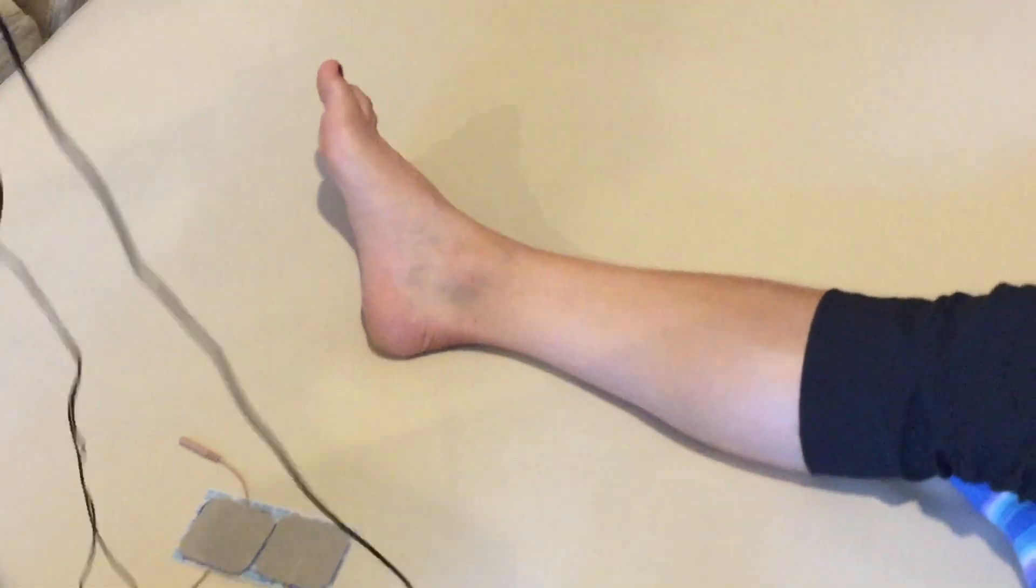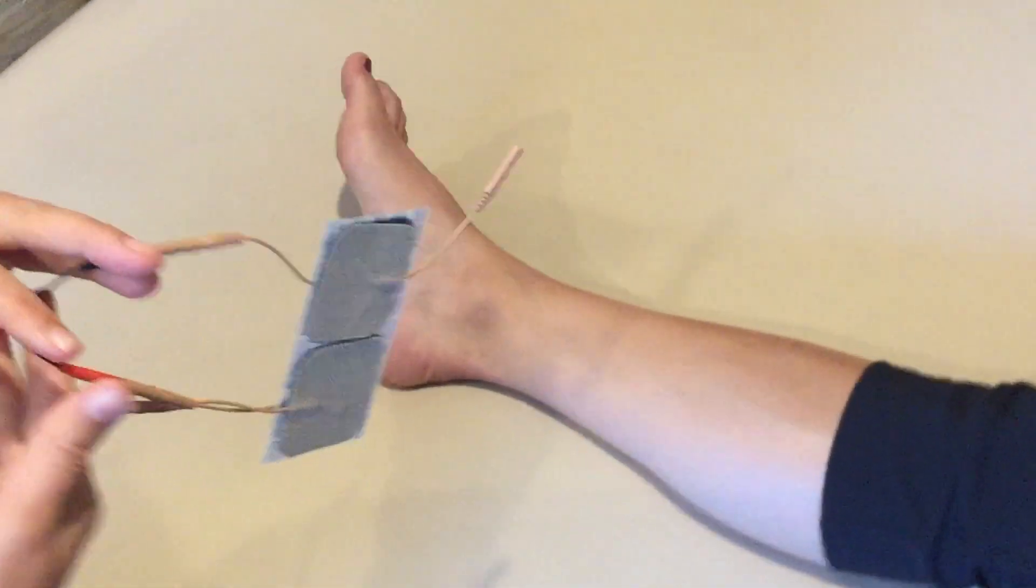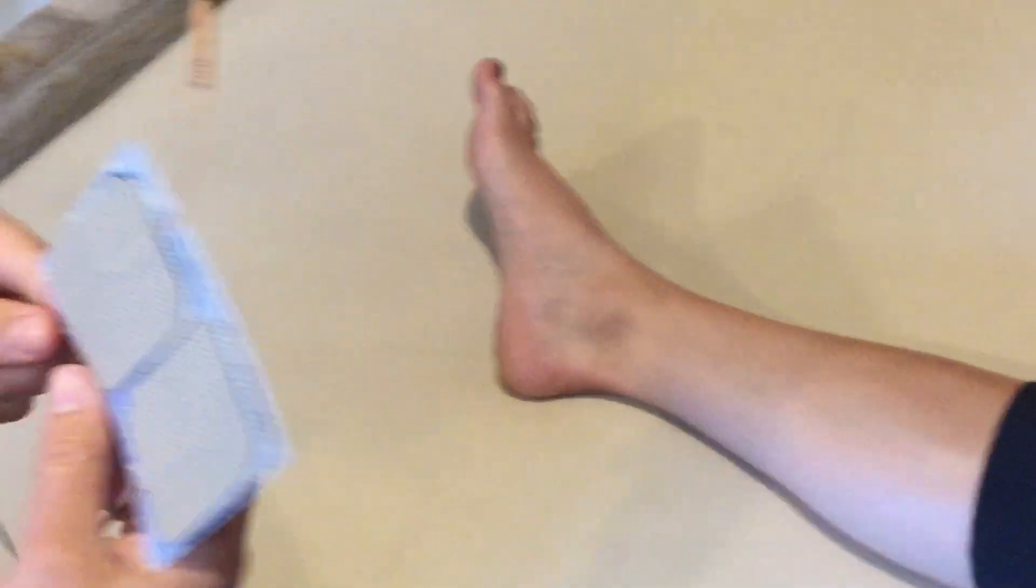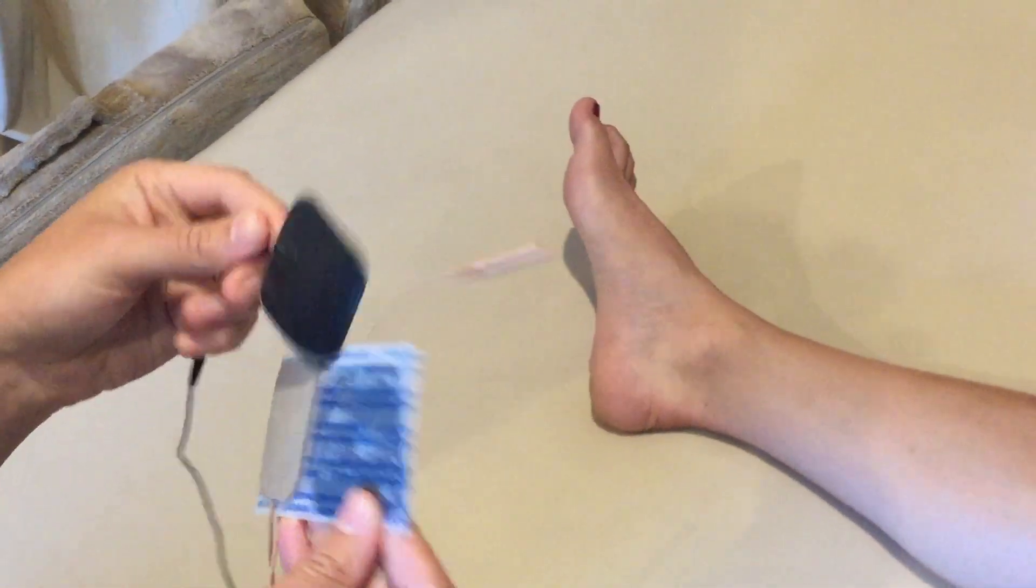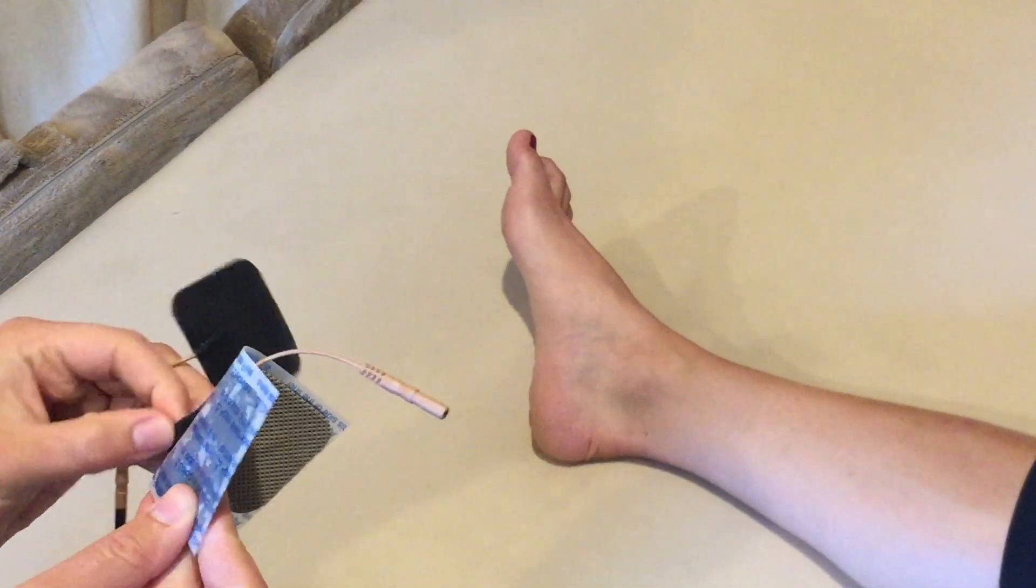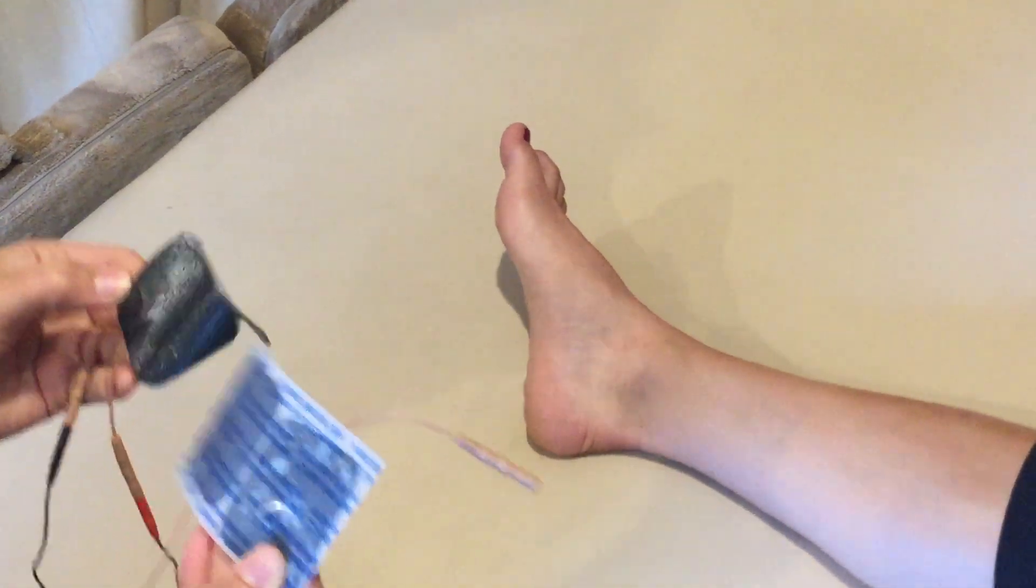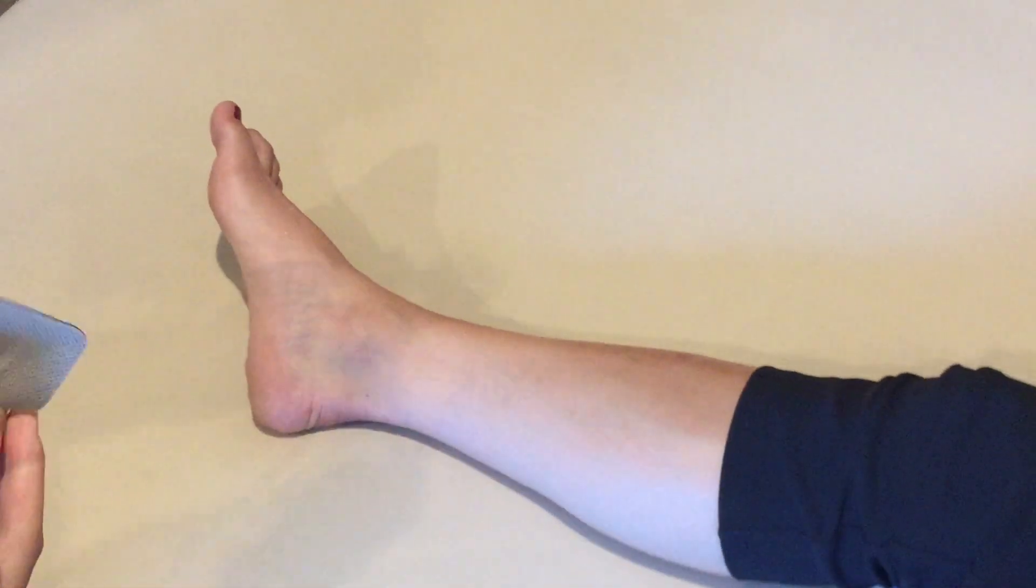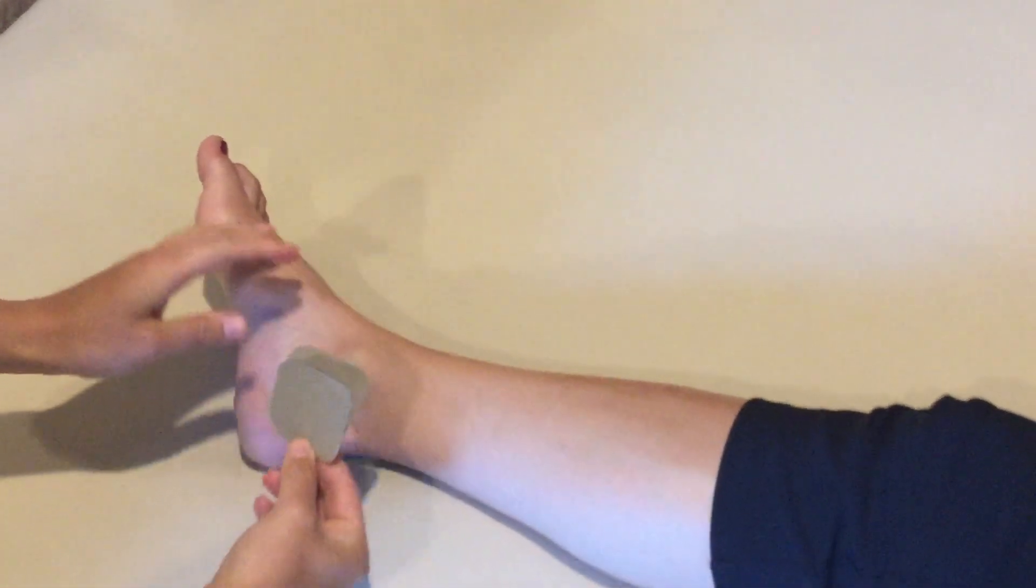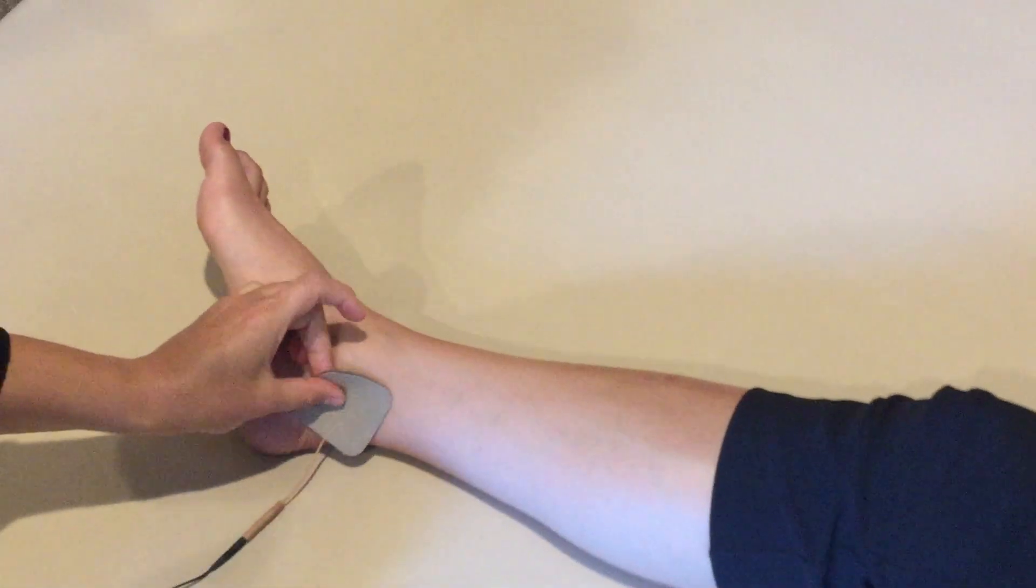We've got our parameters set and we're using one channel which means two electrodes, and we'll place these over the tibial nerve through tibialis posterior muscle. If you find the ankle bone we're going just slightly behind that.